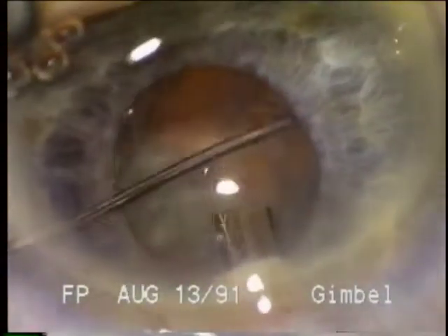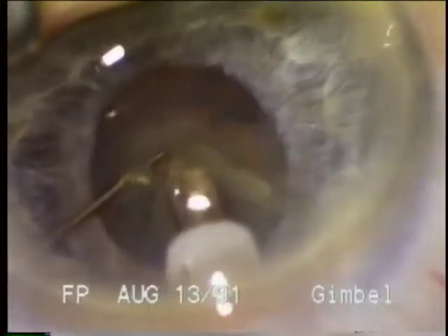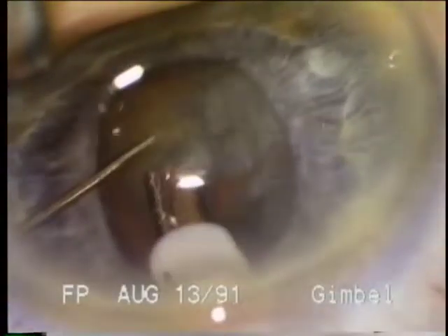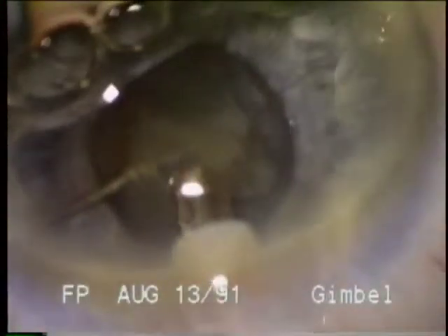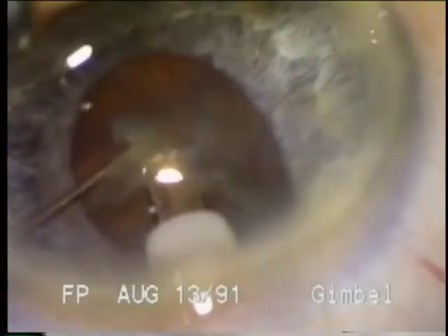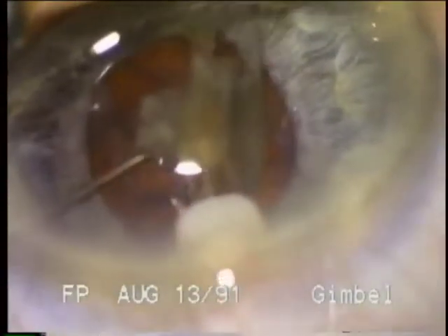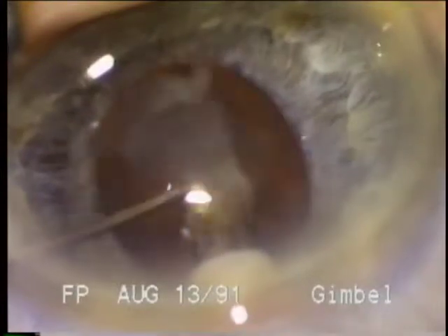These small pupil cases certainly demonstrate the distinct advantage of the nuclear fracture techniques, because we don't have to put the tip of the phaco under the iris, under the capsule, in these small openings in the capsule. There is a risk of the iris flowing unexpectedly with the lens material into the tip of the phaco port. So one should use a lower flow when the pupil is small and reduce efficiency but increase safety.